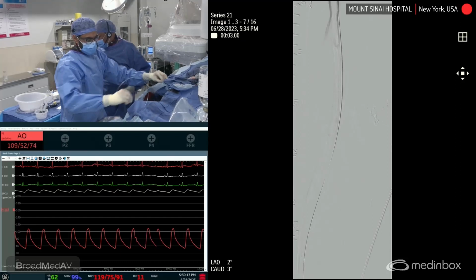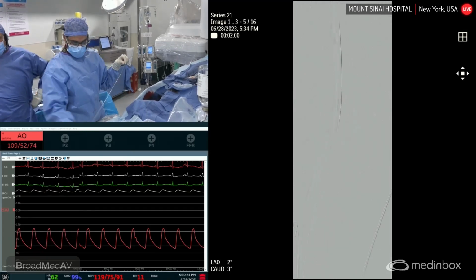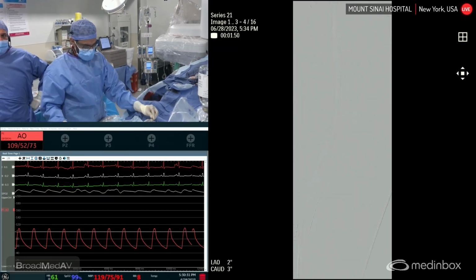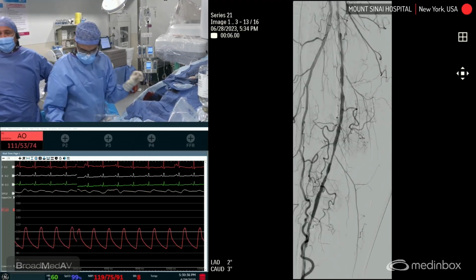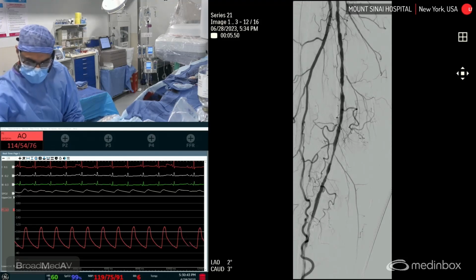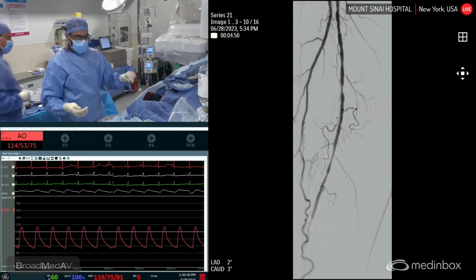Let's get the device. Open the Hawk, please. Hawk M. Hawk X. Hawk M. What's the question? The jet stream? Yeah, definitely. The aspiration occurs all the time, but the catheter is most effective when you're going antegrade with the aspiration. So yeah, the answer is you can aspirate when you're coming back as well. And that's the situation. Looks really good, right? Yeah, we're done. Can you aspirate under low pressure?